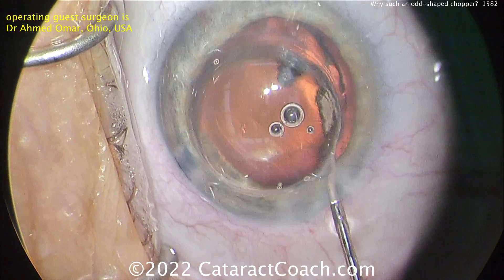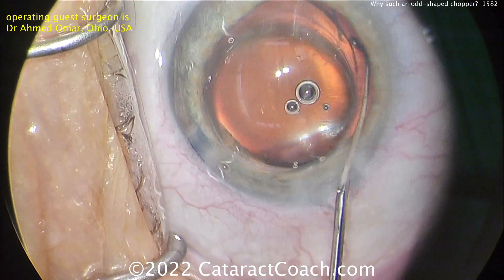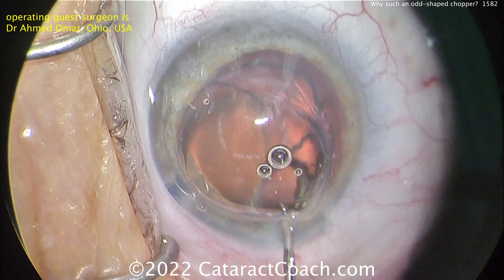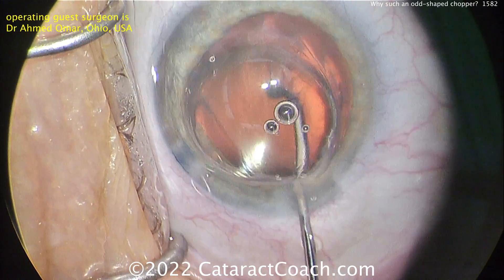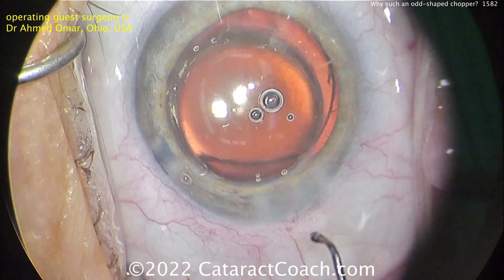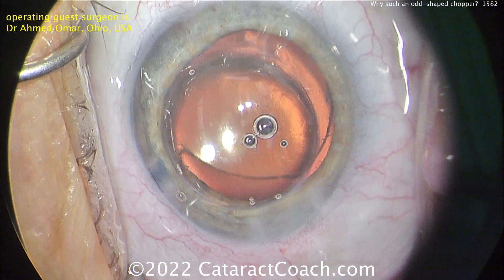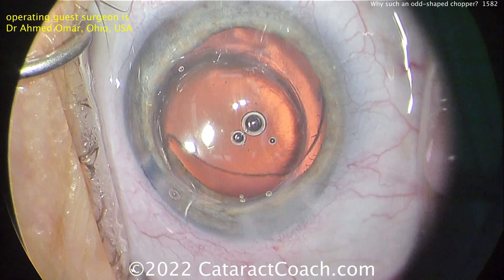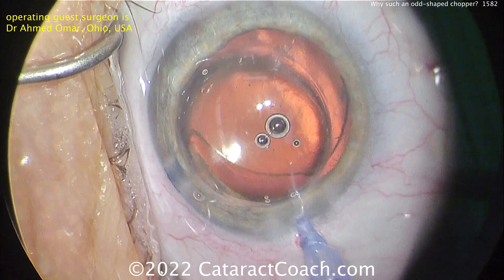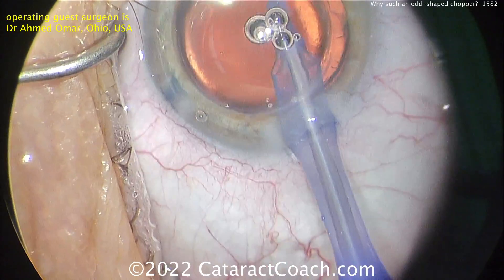Last thing here is when you're doing the sealing of the incision, be very cautious. Don't do some mega-hydration. If you hydrate so forcefully, right at the incision, you can actually end up splitting that graft-host junction — and you don't want to do that. So be very gentle on the hydration of the incision. And if you need to, put a stitch in the eye. In some cases with a cornea transplant, if it's a big graft with a very large diameter, I'll even just do a scleral tunnel.